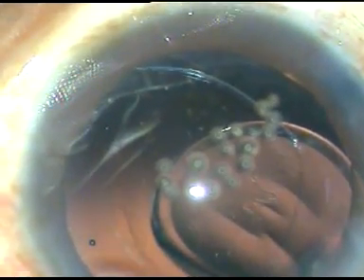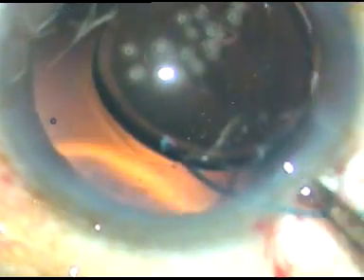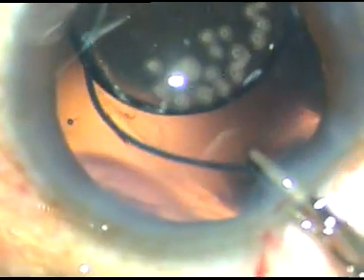For a multi-piece intraocular lens, the tip of the cartridge should go inside the anterior chamber. You are screwing clockwise and the leading haptic goes into the capsular bag. As the lens starts coming, the cartridge is rotated anti-clockwise. A McPherson's forceps is taken, the trailing haptic is held with the McPherson's forceps, and it is placed in the bag.